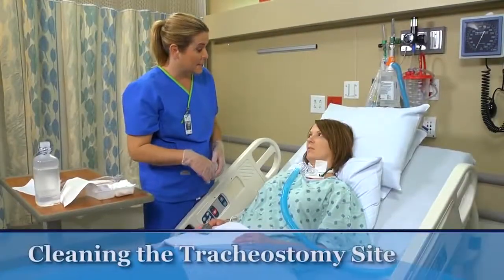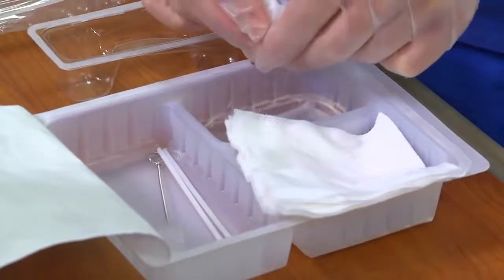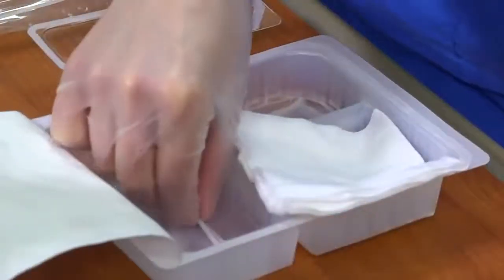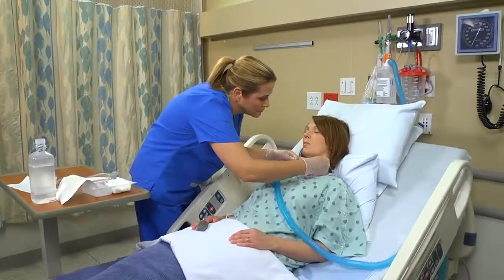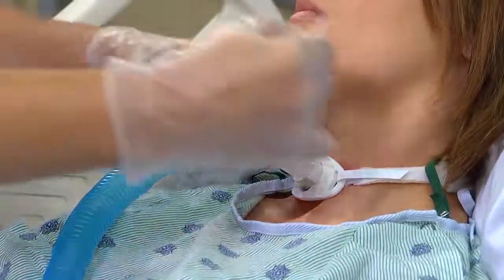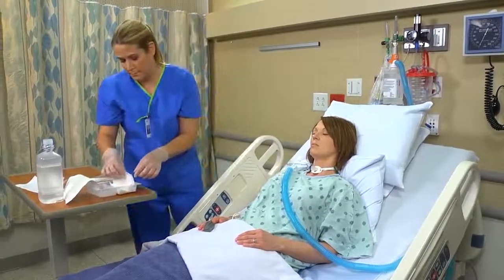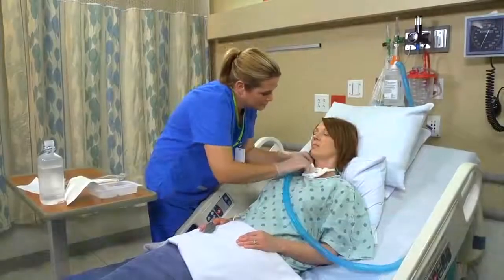With either type of cannula, remove the drainage sponge and use normal saline to clean the exposed surface of the outer cannula. Then clean the stoma, beginning at the inner edge and moving outward in circles, covering a 2 to 4 inch margin around the stoma. Be sure to include the area under the faceplate. Pat dry the skin and exposed outer surfaces of the cannula. Apply a new drainage sponge.